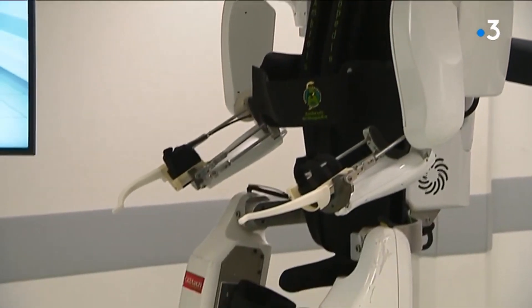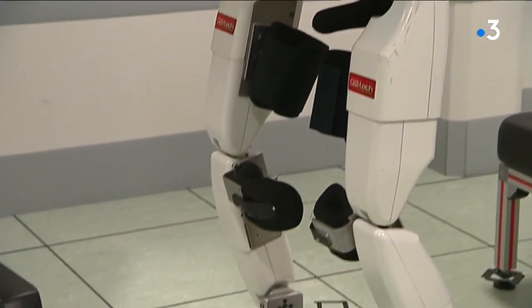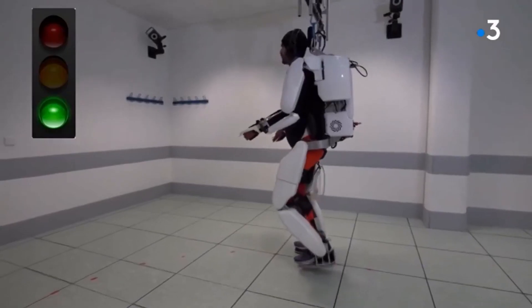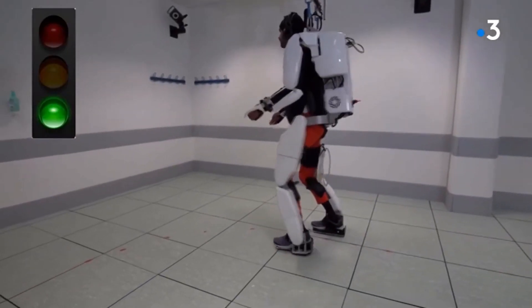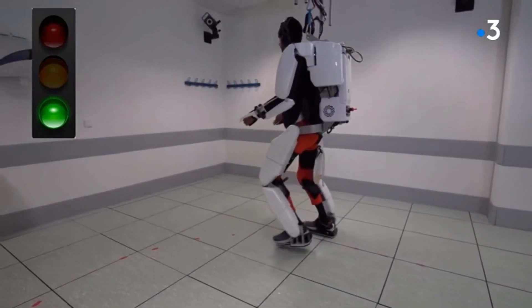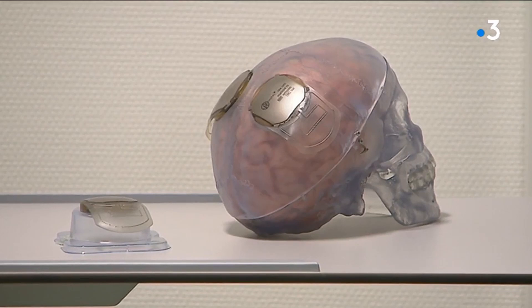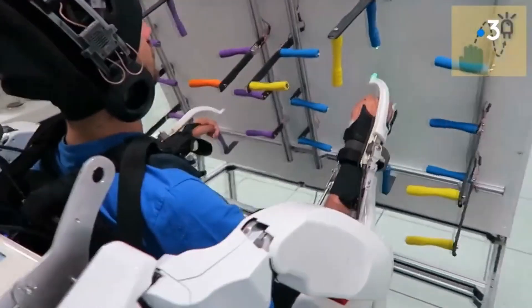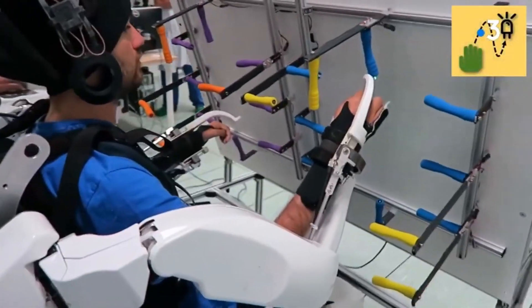This is particularly interesting for patients who cannot move their arms and legs. In a 2019 case study from the University of Grenoble and the research center Clinatech, they developed an exoskeleton to control all four limbs of a tetraplegic patient — something never done before. The exoskeleton was controlled by thought, using an invasive wireless brain-computer interface with 64 electrodes implanted in the motor cortex of the patient.